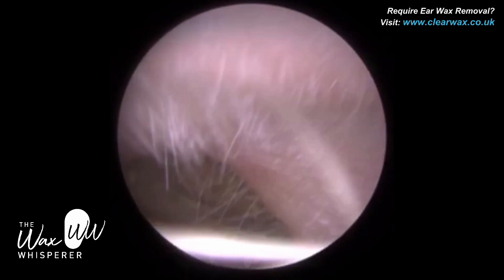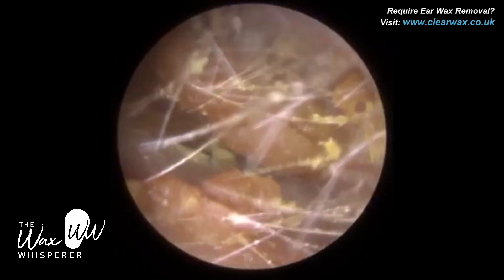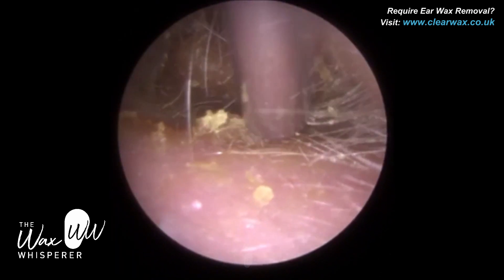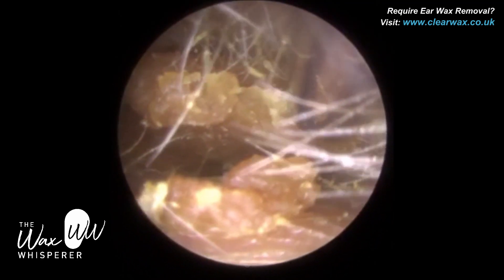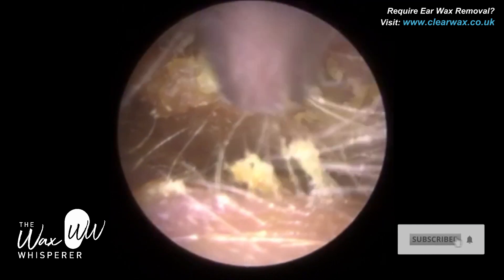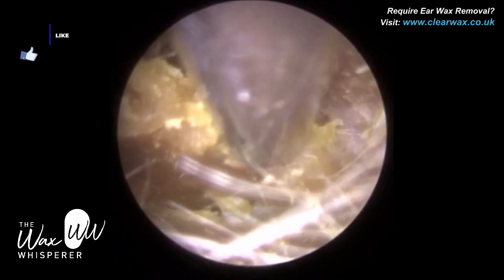The patient in this procedure attended with a blocked left ear, and you can see the patient has fully occluding, quite dry crumbly ear wax extending right from the ear canal entrance all the way to the eardrum. The patient is also suffering from otitis externa, which is an inflammation or infection of the outer ear canal.